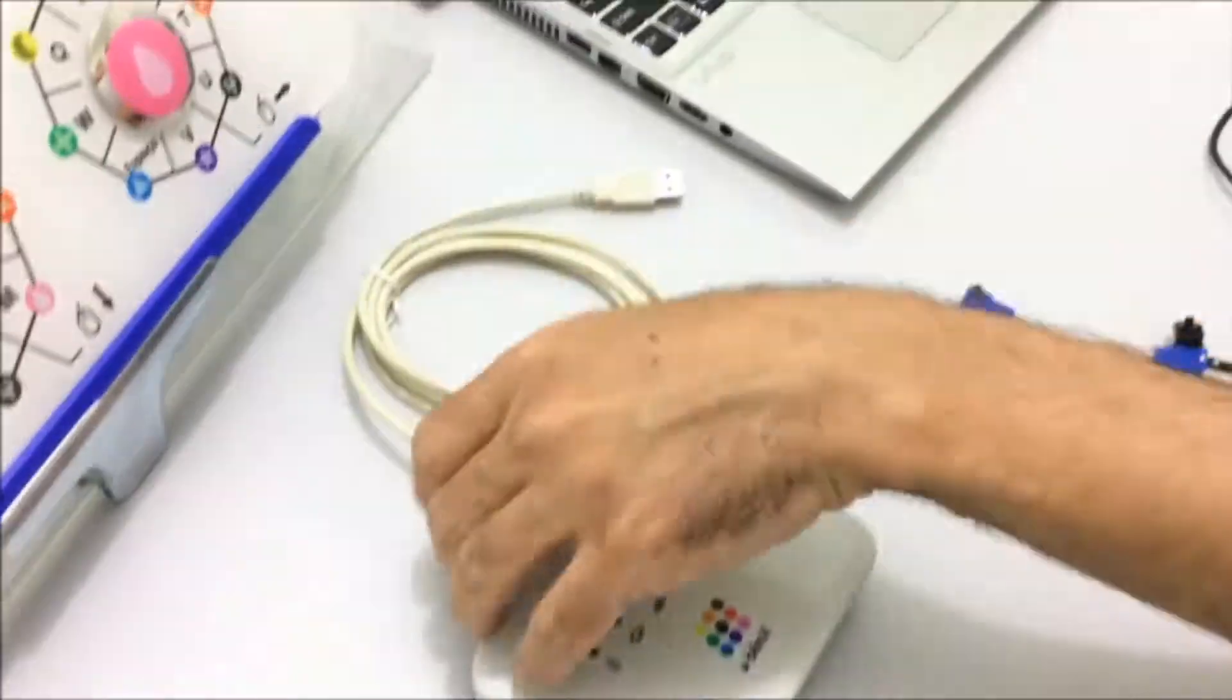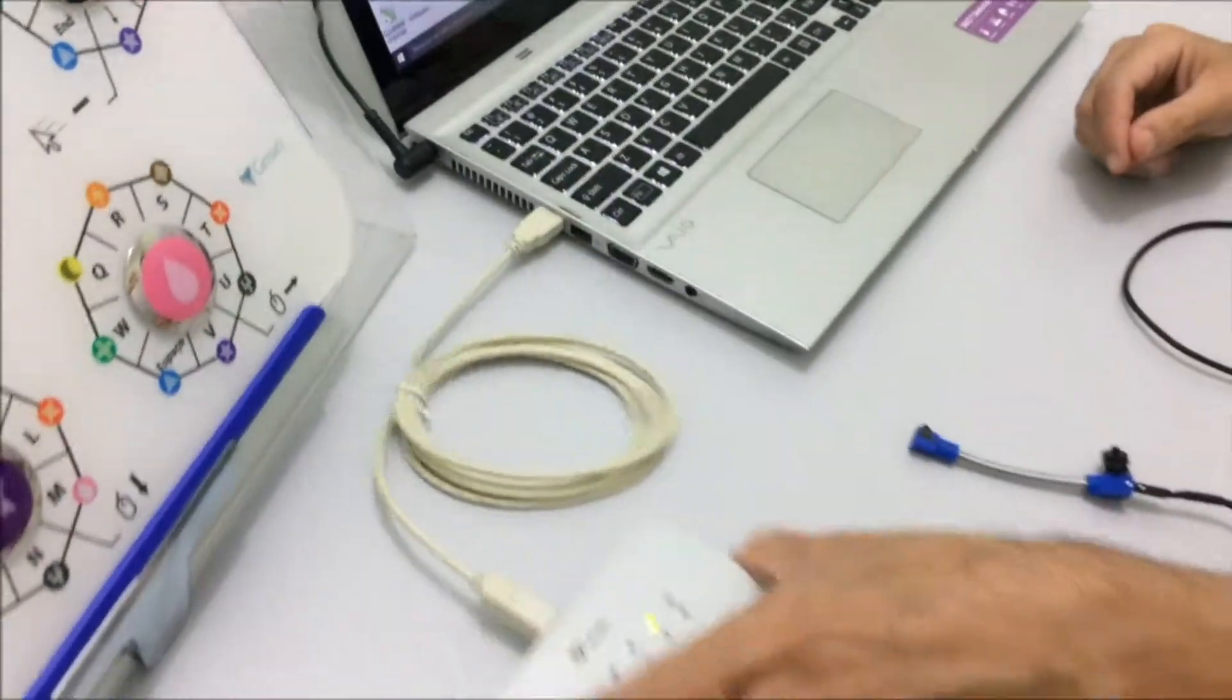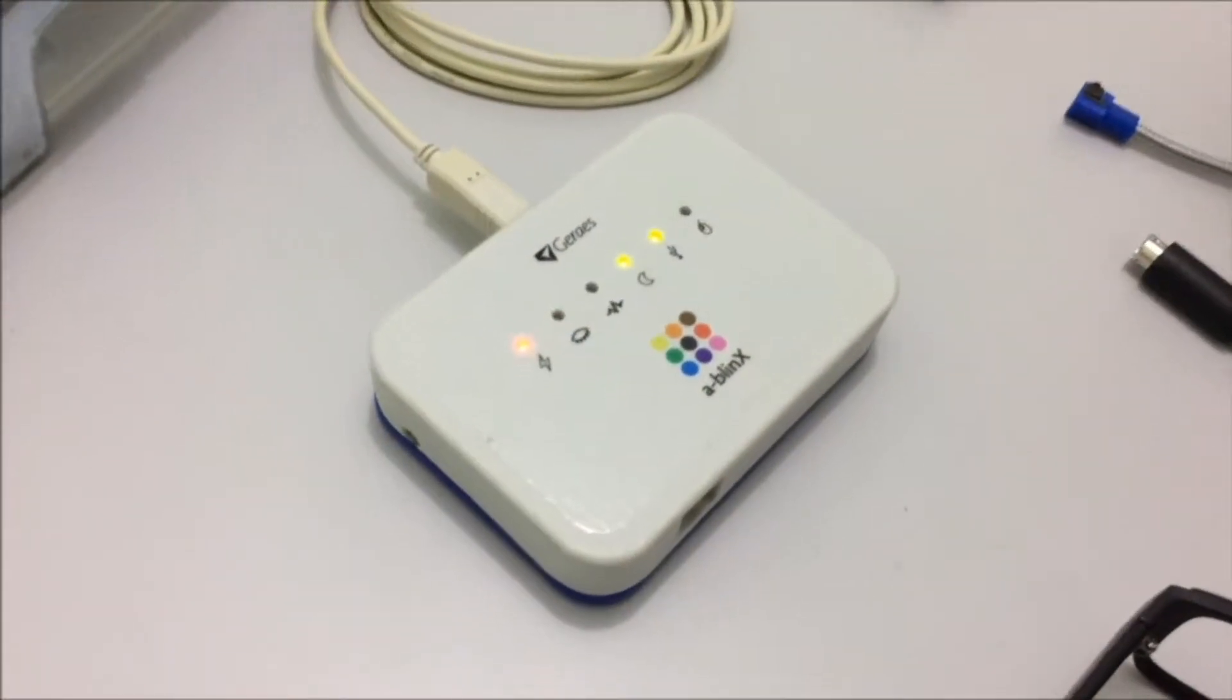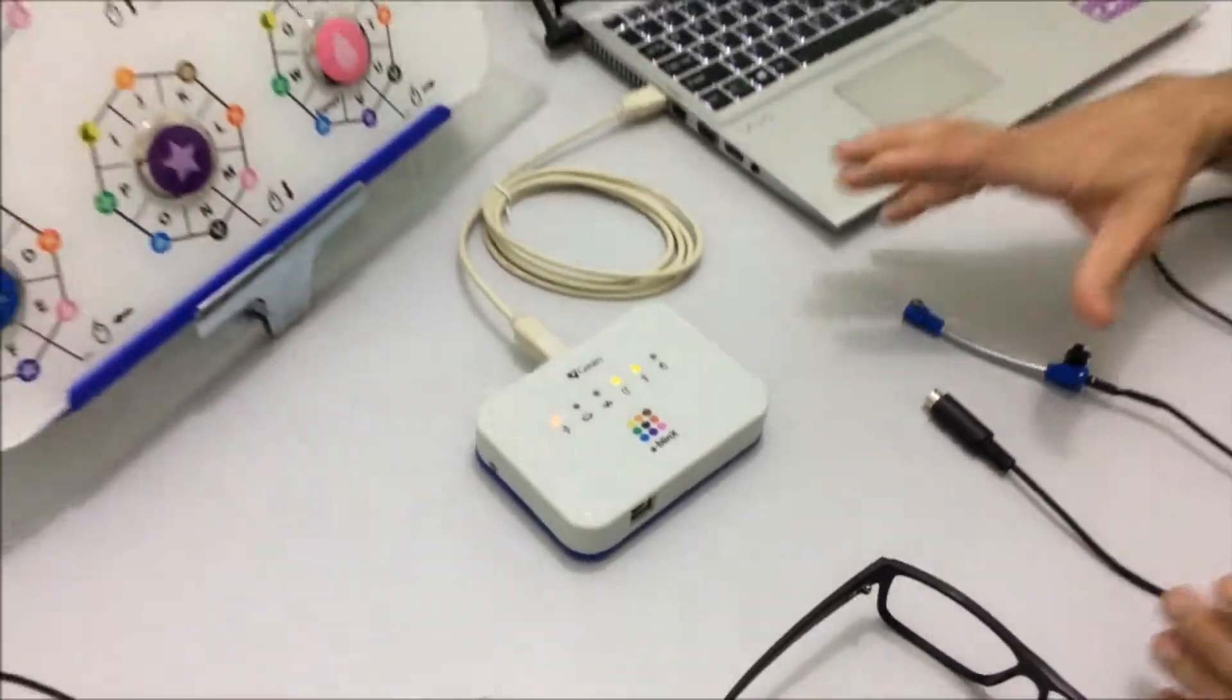To turn on Blink X, we use the USB cable, plugging the squared end into Blink X and the flat end to any USB port on your computer. When you plug it in, it will turn on the lights and make a little noise.